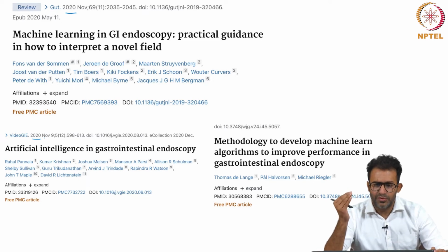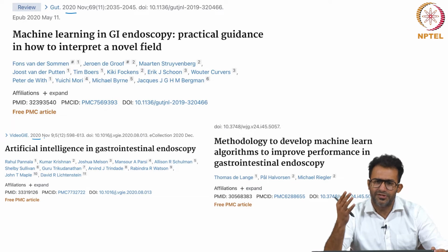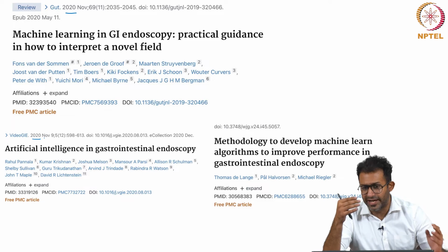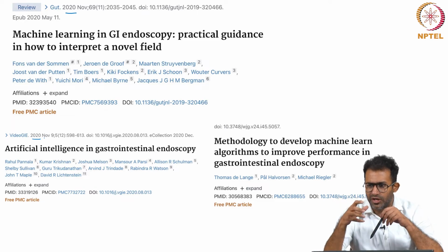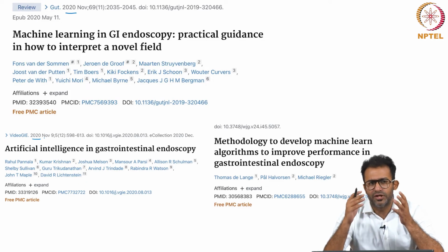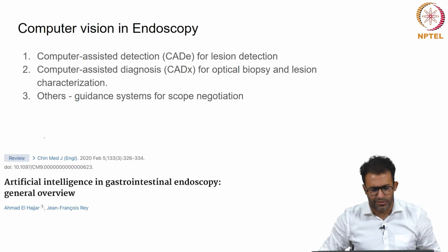One of the major challenges in adoption is that clinicians have not warmed up to the idea of using artificial intelligence for diagnosis. There's still a lot of resistance among clinicians to using artificial intelligence techniques. There's a huge perception of how a machine can understand a diagnosis or a cancer or a particular polyp better than a human, and evidence has been conclusively mounting that machine learning techniques are improving and are proving to be better than clinicians in understanding endoscopy and making endoscopic diagnoses.